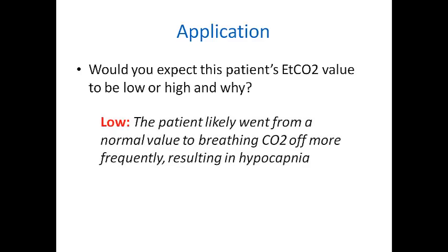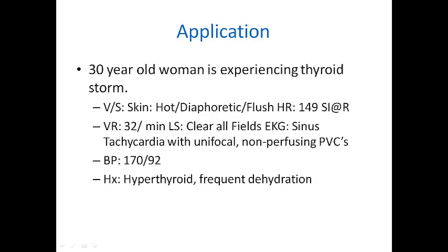We would expect the value to be low. The patient was likely normocapnic, and when they started to increase their ventilatory rate, they blew off CO2 faster than they needed to.